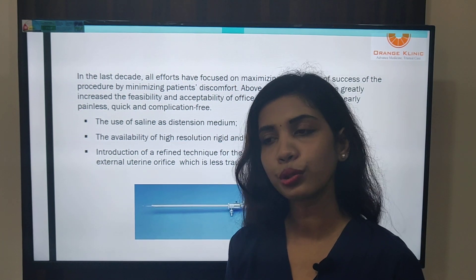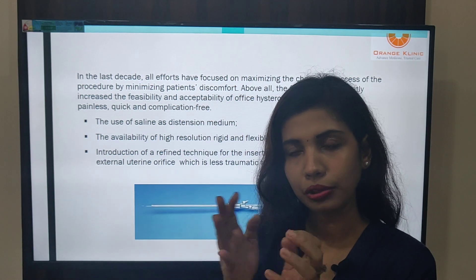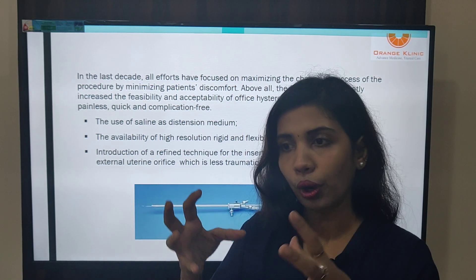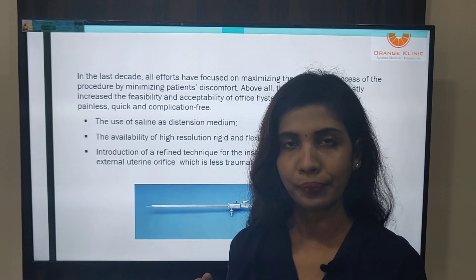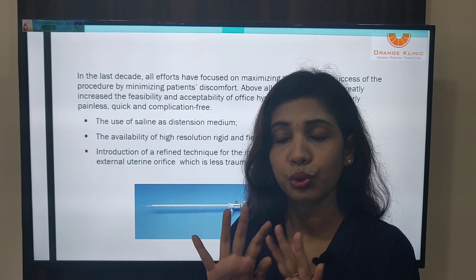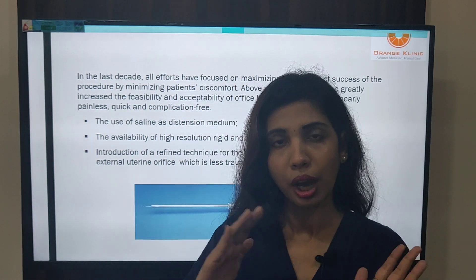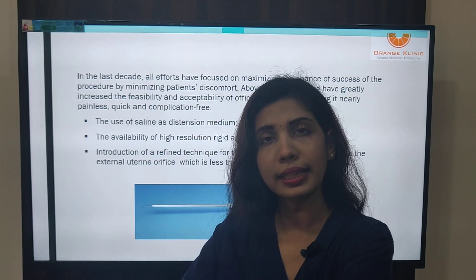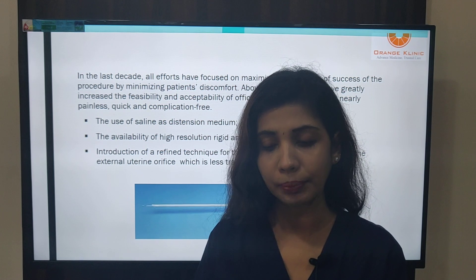Earlier, people used to hold the vulva so that the vagina becomes a cavity, and the water distends it so we can see the external os easily. But now the technique is we do not touch the patient at all. The patient is comfortable — this is an office setup. We do not want to touch the patient or cause her any pain.